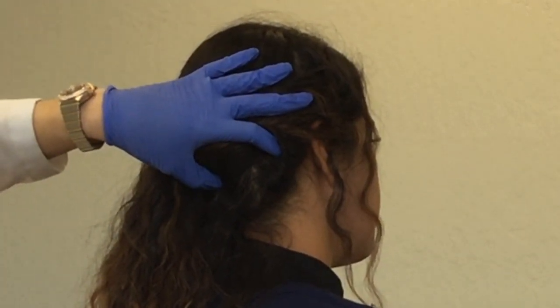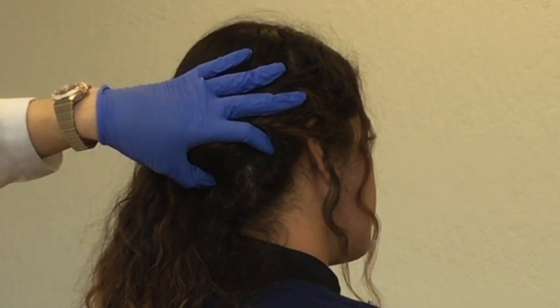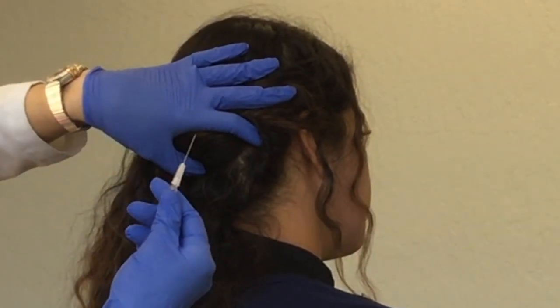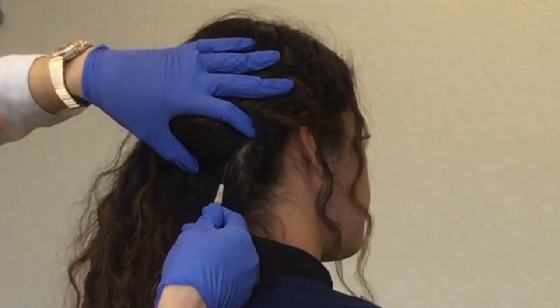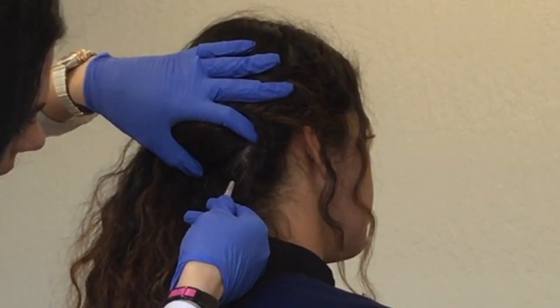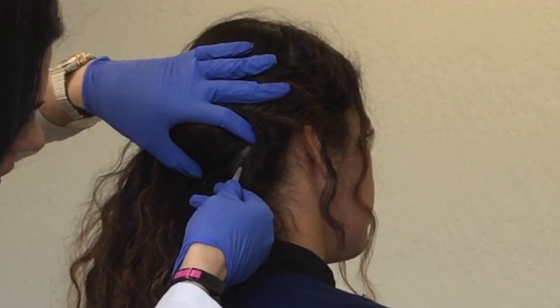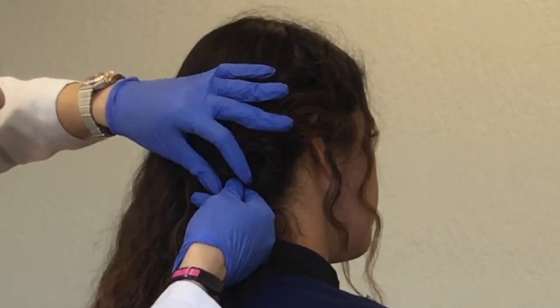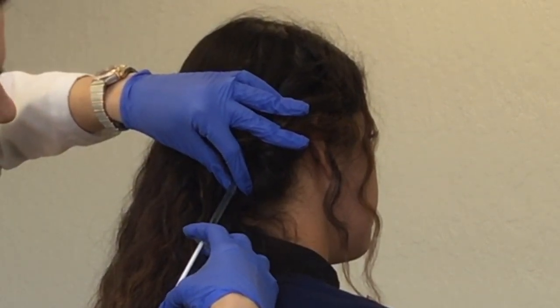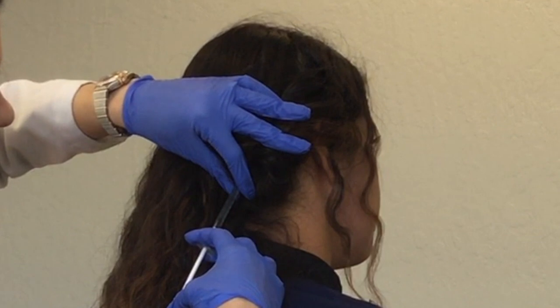Then grab your syringe, make sure the bevel side is up, and go into your injection site and just poke it in like so. Hold it. If you hit the skull you can pull back. Pull the plunger back, making sure you're not in a vein or an artery.